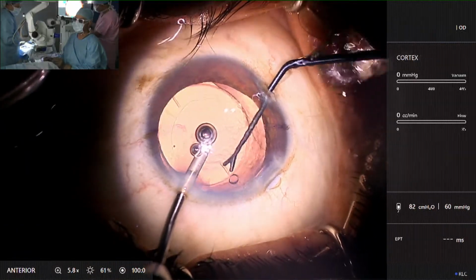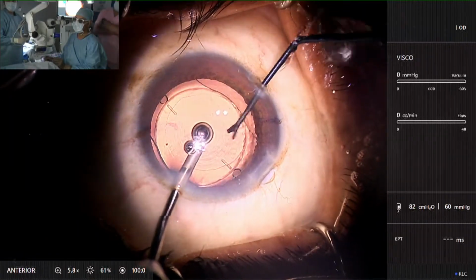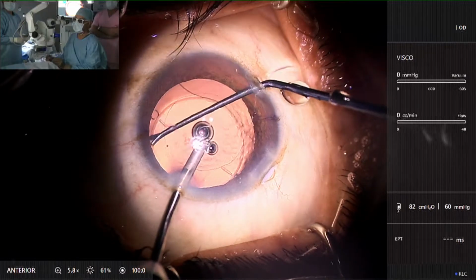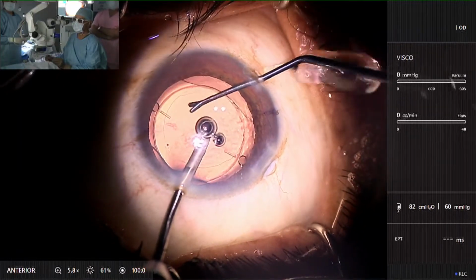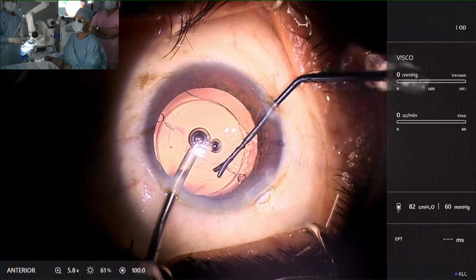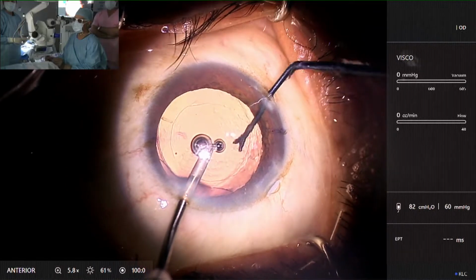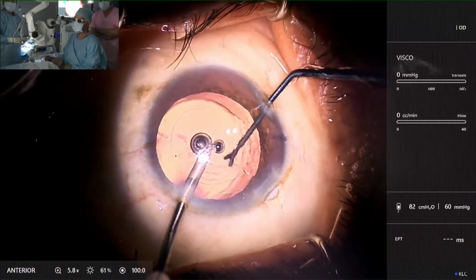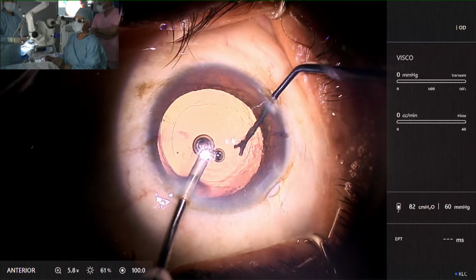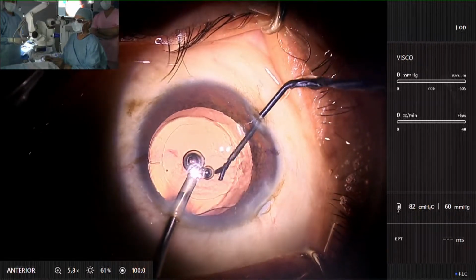So this lens is amazing. I've been using a lot of toric lenses from Zeiss also, and many people think that they are hydrophilic and will not be good. But I have had a great experience. The centration and the positioning is very good because it's a 4-point haptic, and the PCO rates are negligible. Even with these hydrophilic lenses, which I'm using as trifocals, I have not seen PCO. I've been using big numbers over the last 2-3 years. Most of my cases are now 3 years old or even longer.